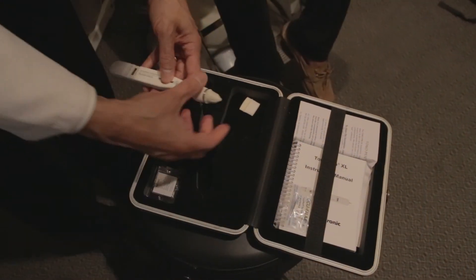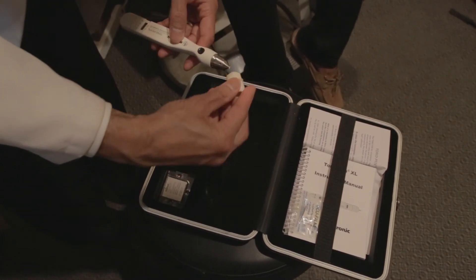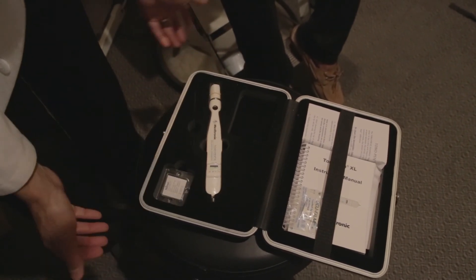When you've finished checking pressure, discard the used rubber tip. Before putting the Tonipen back in the box, apply a new tip, leaving the cardboard in place to protect the sensitive tip, and then place it back in its holder.